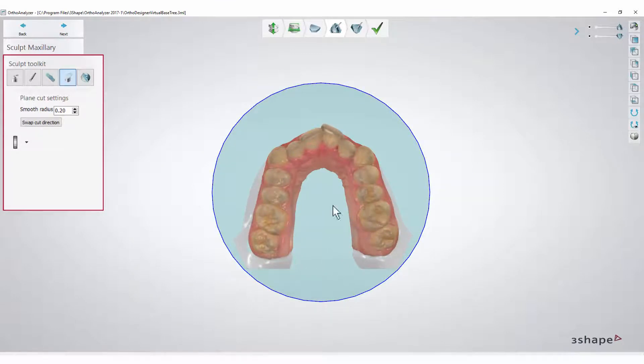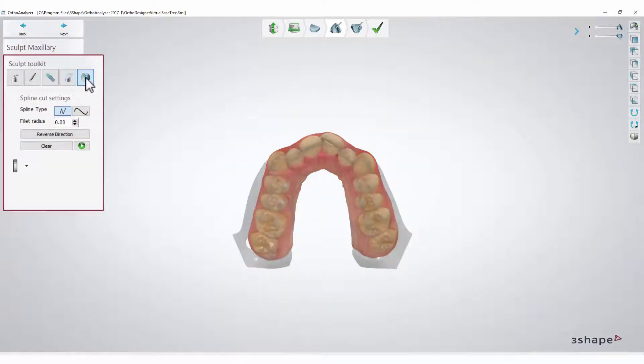If you want to cut off other parts as well, you can select the Spline Cut tool. There are two different ways to do this. The first method is to select Curved Edge. To cut off the base, start by drawing the first point, making sure not to touch the base, and then making a spline line over the base.